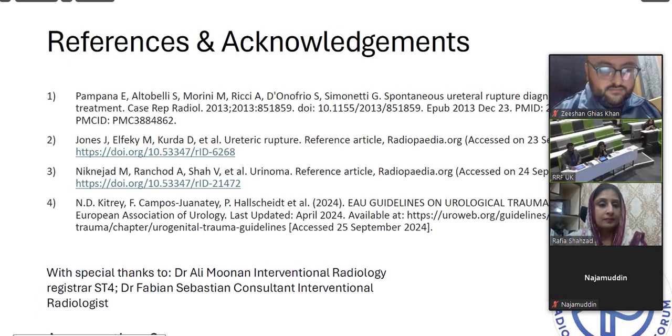Initially, when this patient came in, was there suspicion of a possible urinoma? Were there urinary symptoms related to the problem? So she had recurrent UTIs. Dipstick was positive for a UTI. However, she was non-verbal and unable to communicate very effectively, and so I think there were a lot of assumptions made. The CT was done pretty early on because they weren't sure exactly what the cause was. But because of the history of recurrent UTIs, they went for a CT to look at whether there was any intra-abdominal pathology to cause these symptoms.